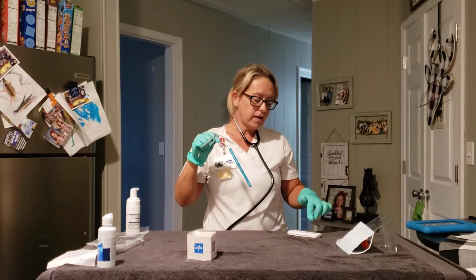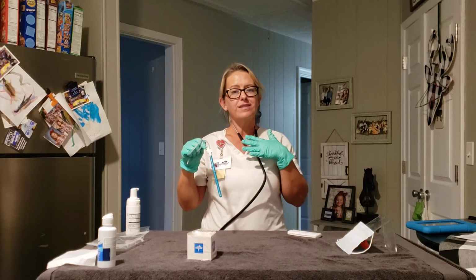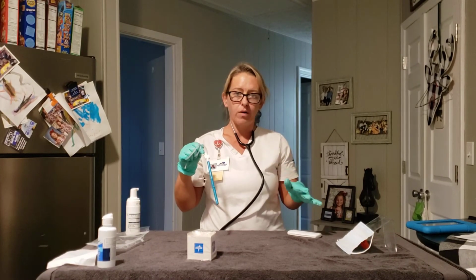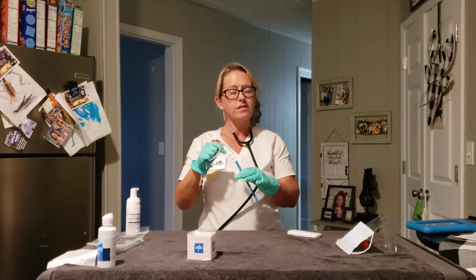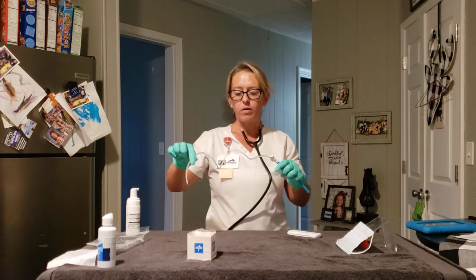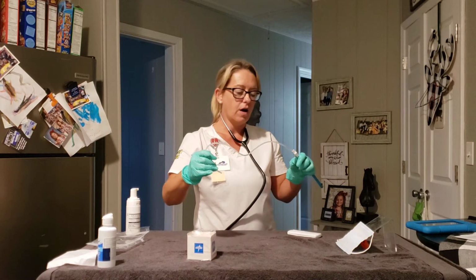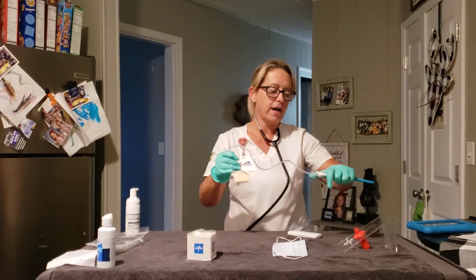Go ahead and check the O2, which is still not where I want it. And I'm going to go ahead and listen to her lung sounds again. Still not where I want them. They're still not clear to me. So therefore, I'm going to do a second suction. But before, I'm going to go ahead and clean my suctioning tube. Okay, and then I'm going to remove her mask.